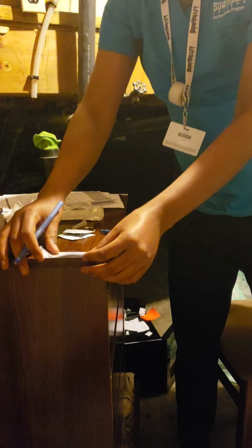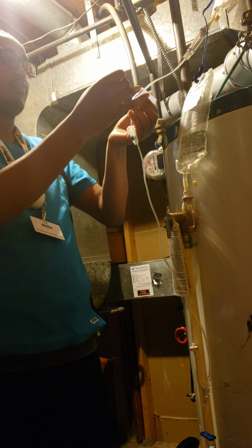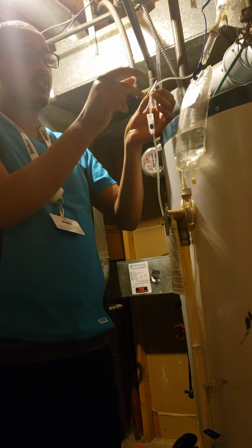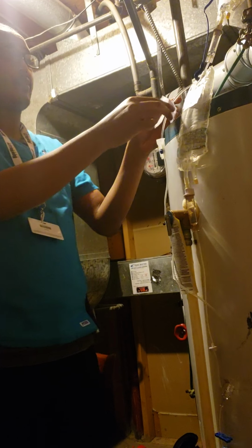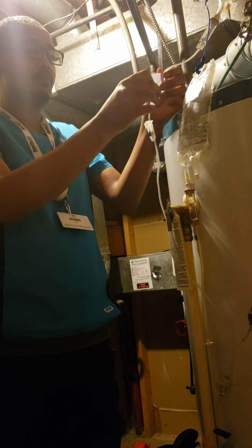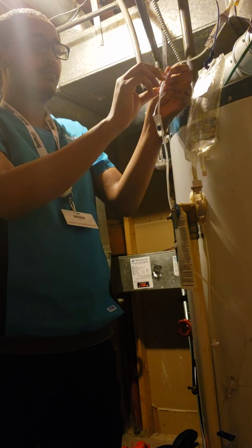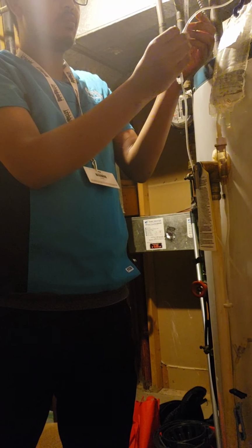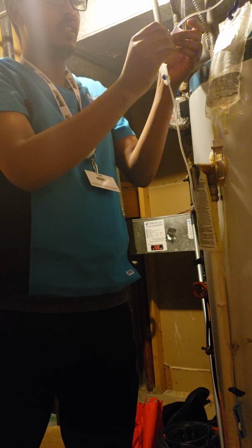Okay, so I have to just connect it to my secondary IV line. Okay, so I have to connect it.